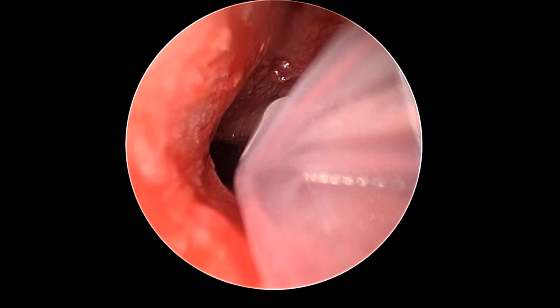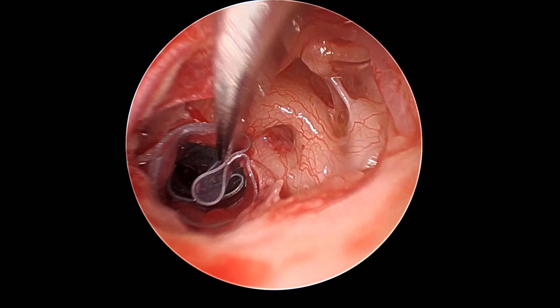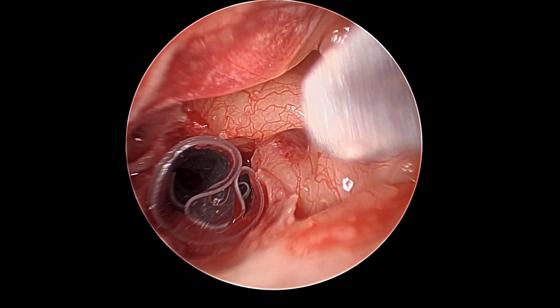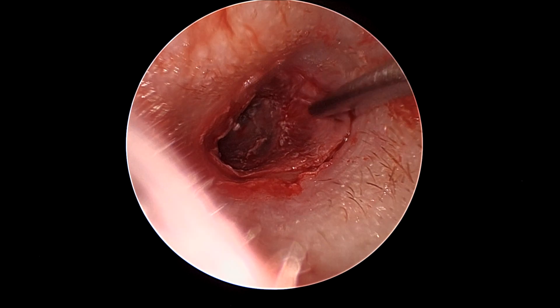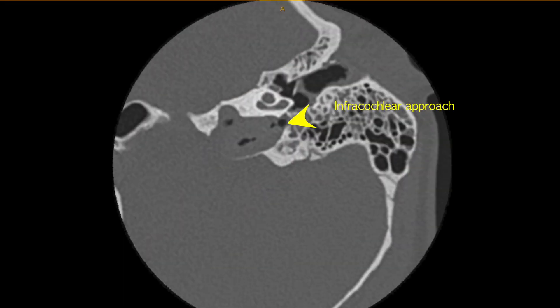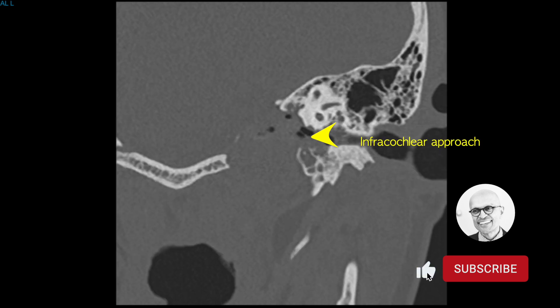A 0.13 millimeter silastic is then fashioned as a stent and placed into the opening, and then this is unfurled with a drum elevator to create a patent lumen within this stent which will hopefully create a patent long-term opening. The tympanomeatal flap is then returned and the ear canal packed with gel foam and siloxone. On axial as well as CT scan two weeks post-op we can see a nice infracochlear opening here, preserving the cochlea, and again on coronal imaging nicely preserving the cochlea.